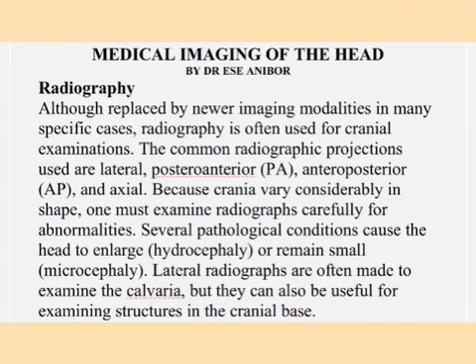The common radiographic projections are lateral, posteroanterior, anteroposterior, and axial. The cranium in various persons varies in shape, so you really need to do thorough radiographic examinations to appreciate abnormalities of the cranium.